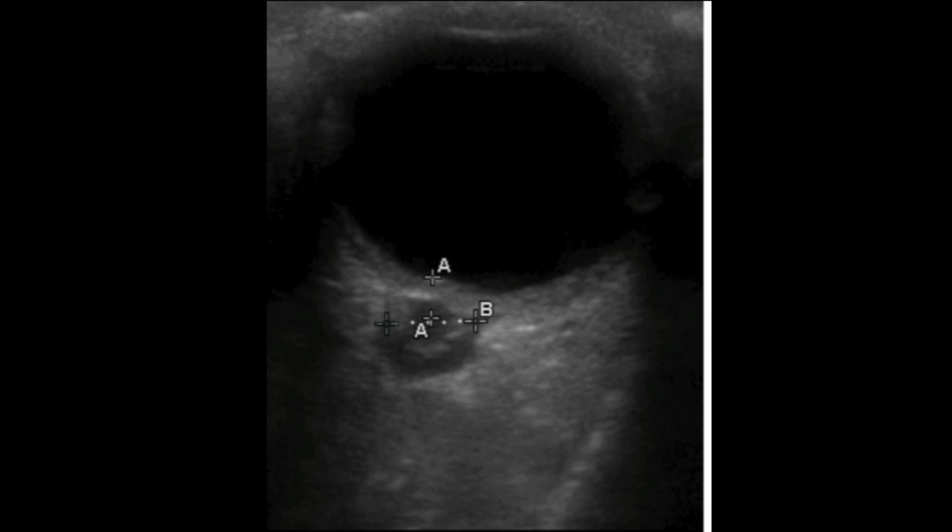So it's 5 millimeters down, I think. So 3 millimeters down from your retina, and then you measure across your optic nerve. And if it's more than 5 or 6 millimeters, certainly above 6 millimeters, that is abnormal. And you've got 2 eyes. Okay. So scan both of them because there might be a local cause for that optic nerve to be dilated.